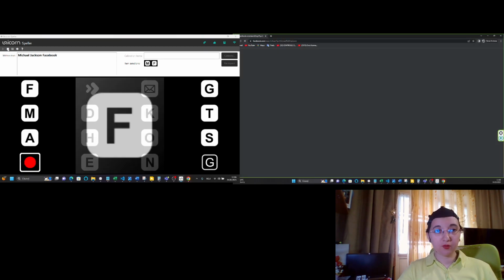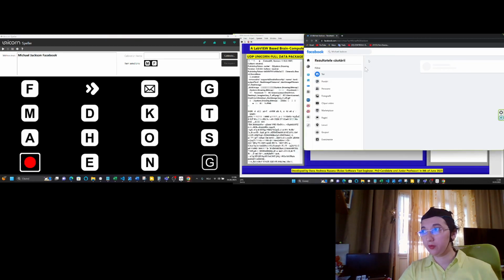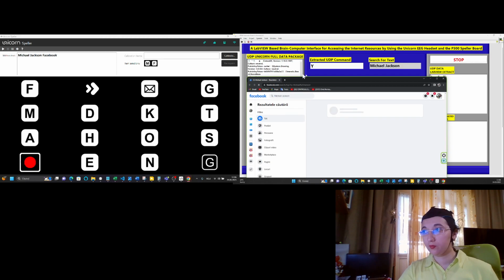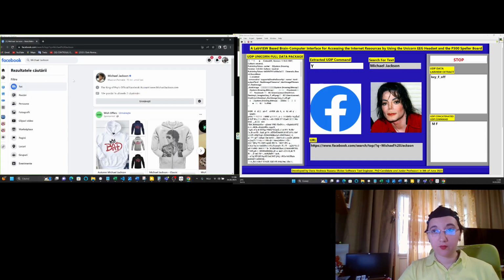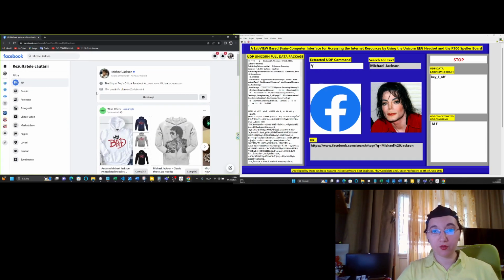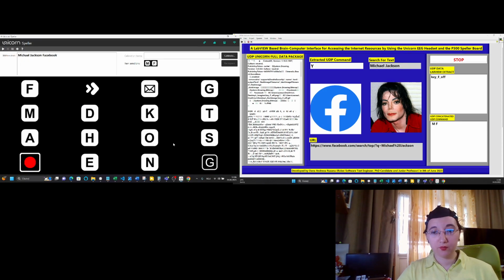I will stop the application to check in the internet what happened. So here we can see that the Google Chrome browser was opened on the Facebook page and now we see that the search option was the Michael Jackson text, and here we see the related content of Michael Jackson. We will continue with Adele.